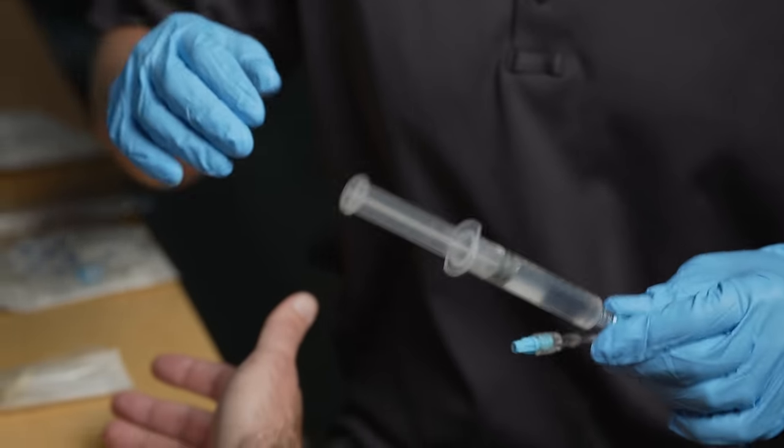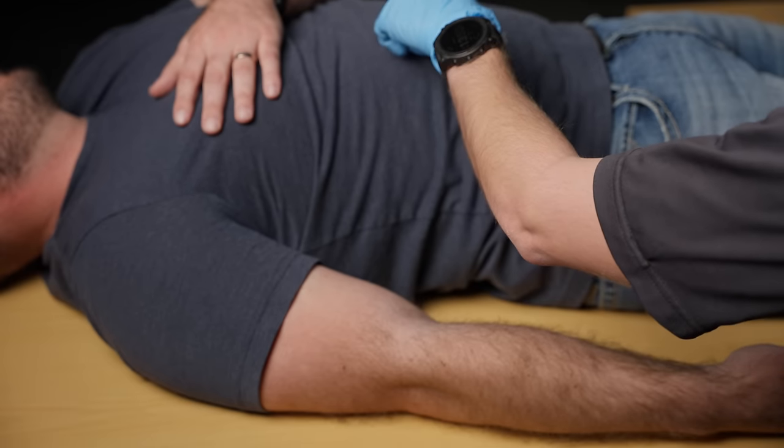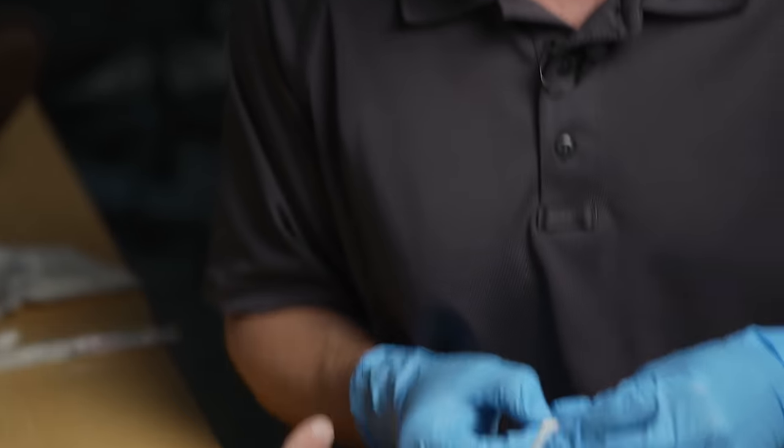It's a little bit unorthodox but especially in an ambulance, the patient is often the easiest place to put this stuff because it's an easy arm's reach and a lot easier if you have a partner doing it with you as well. I'm going to get the chlorhexidine ready to go, keep it in the package, and now I'm going to get all my tape ready and just prepare myself for success.